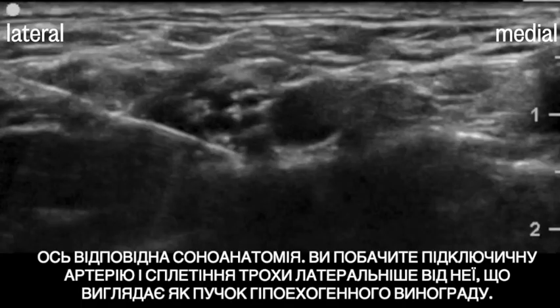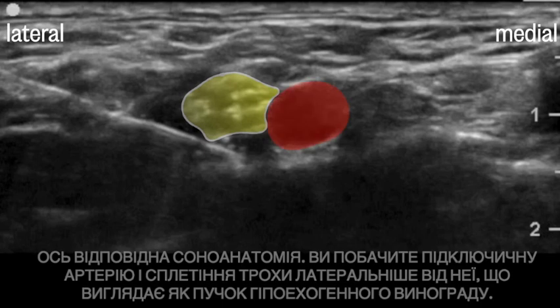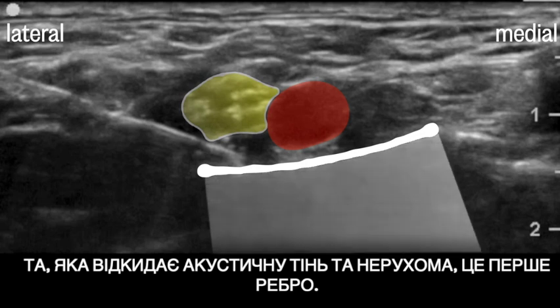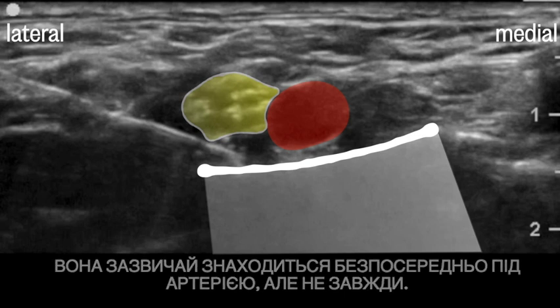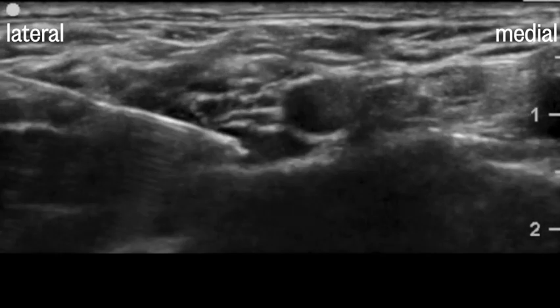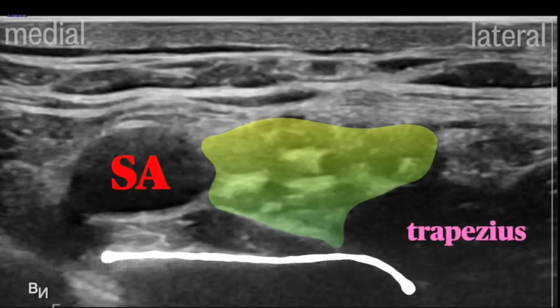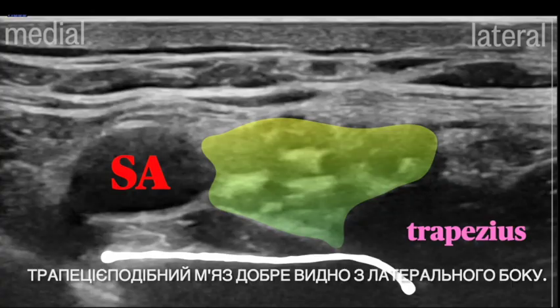Here's the relevant sonoanatomy. You'll see the subclavian artery and the plexus just lateral to it, appearing like a bundle of hypoechoic grapes. Underneath the artery, you'll see a few bright white lines, and it's important to know which is which. The one that casts an acoustic shadow and is immobile is the first rib — it's usually directly under the artery, but not always. Beside the rib shadow, you can appreciate the pleura, which is shimmery and slides from side to side with respiration. The pleura doesn't cast acoustic shadows. You can also see the plexus lateral to the artery with the rib underneath, and the trapezius muscle seen prominently on the lateral side.